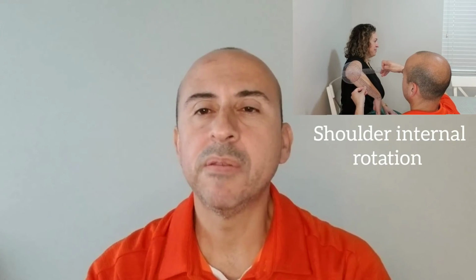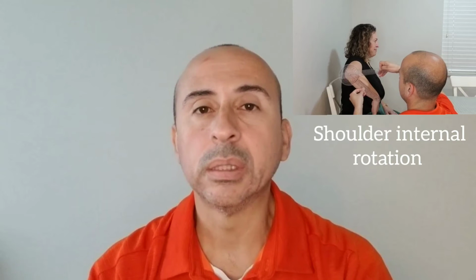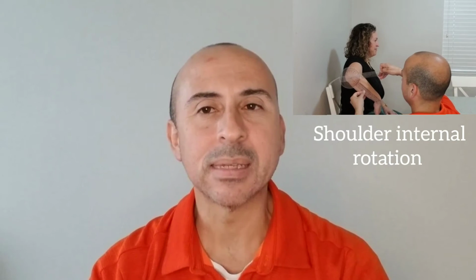I think even before you learn the degrees of movement that each joint has, it's going to help you a little bit more to get there if you really have a strong foundation as to the terminology for the joint movement and the plane that movement takes place.